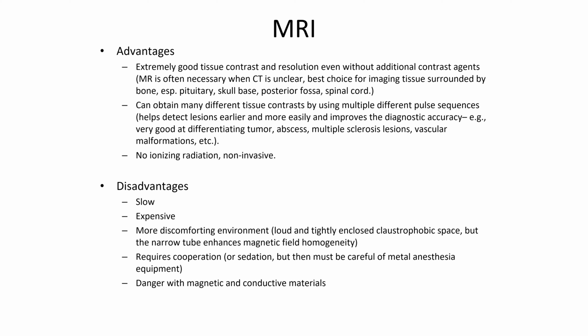That really helps us pinpoint the diagnosis. And it's no ionizing radiation. It's non-invasive. It's incredible. The disadvantages are that it's very slow, it's expensive, and it's a quite uncomfortable environment. If you've ever been in one, they're a very small hole. It's not like the hole on a CT scanner, which is large.